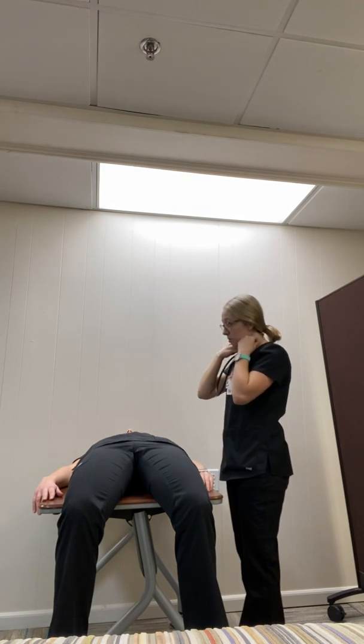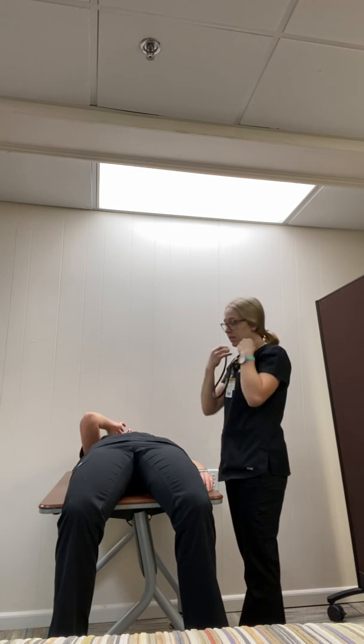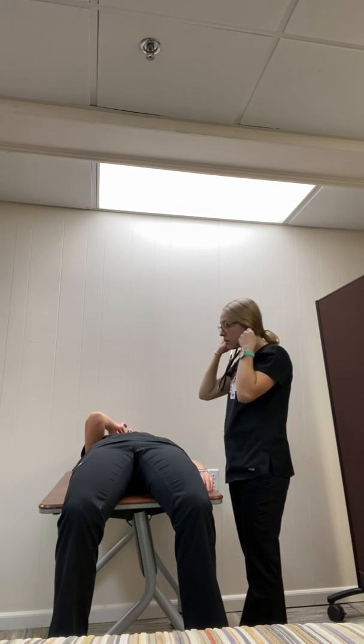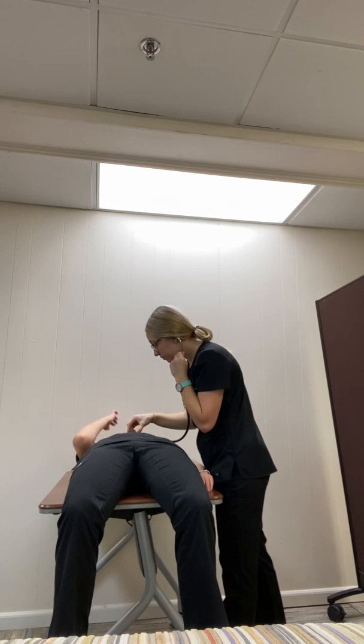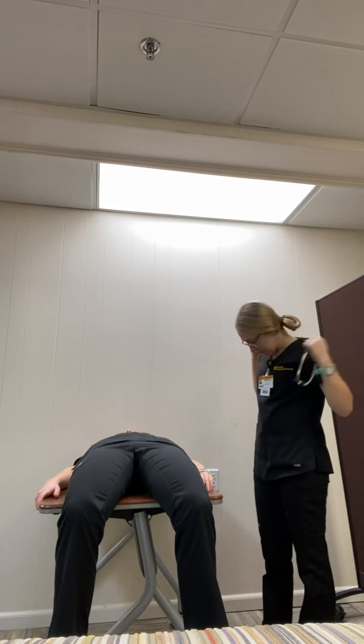And then now I'm going to assess for bruit. So I'm going to be using the bell of the stethoscope. And that also auscultates clearly.